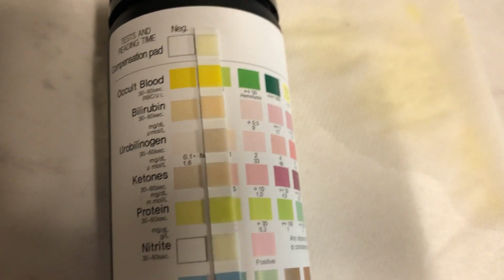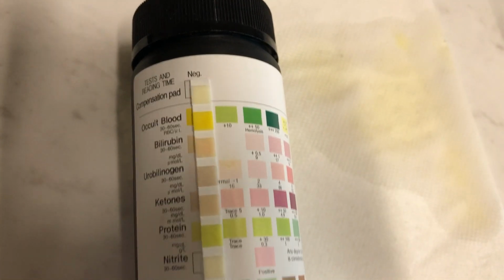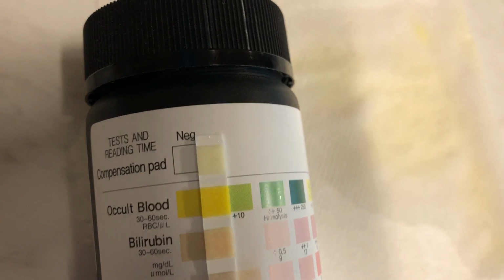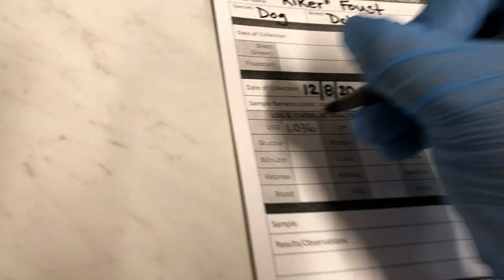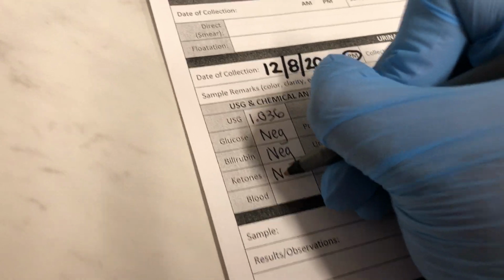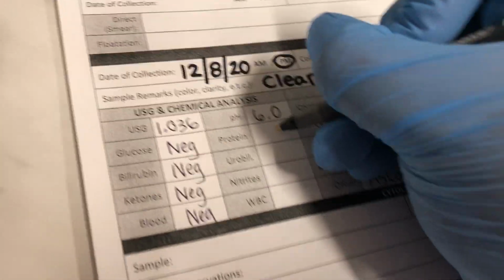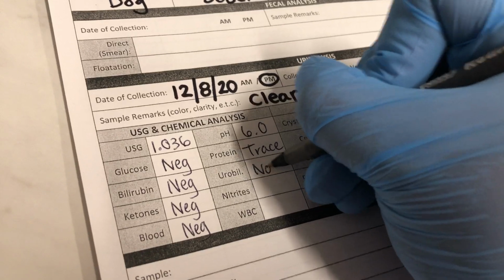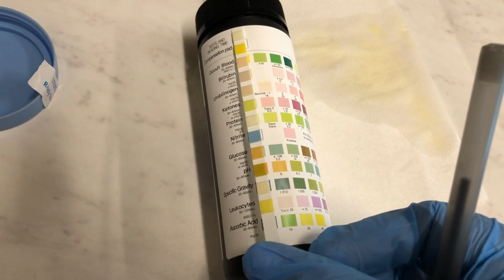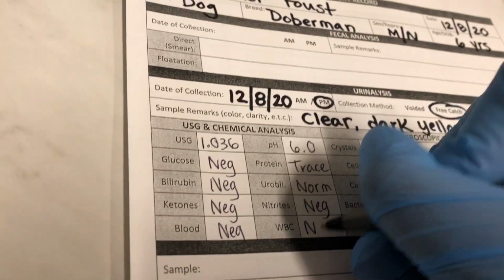Protein is probably trace. It's probably that first green square there. Ketones negative, urobilinogen is normal, bilirubin is negative, and then blood is negative. So I'm going to record all of those. So you can write negative. pH I said was 6.0, protein was trace, urobilinogen was normal, nitrites were negative, and it's probably been about 2 minutes now for the leukocytes. That's the one that takes the longest to read. Leukocytes, that second one from the bottom, did not turn any shade of purple, so that is negative as well.